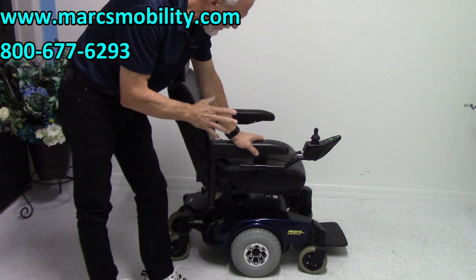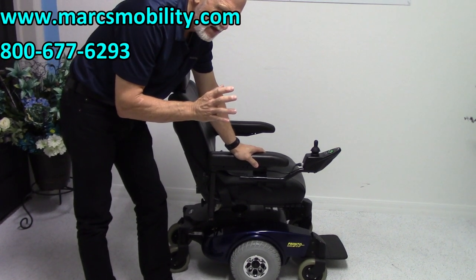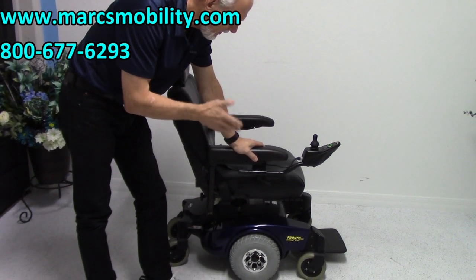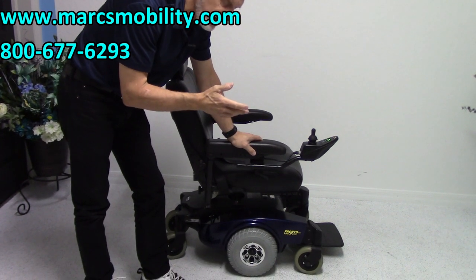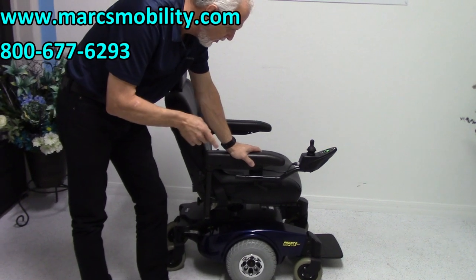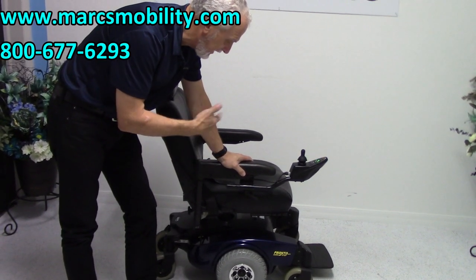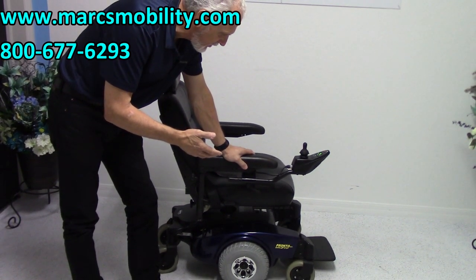This chair was used for about three or four months. The motors are a little noisy — that's normal for this. Some of these motors are like that; that's just the way they are. You can hear the motor later on when I go outside, but they're both the same noise. They may not even be broken in yet; they'll probably get quieter as you break the chair in.